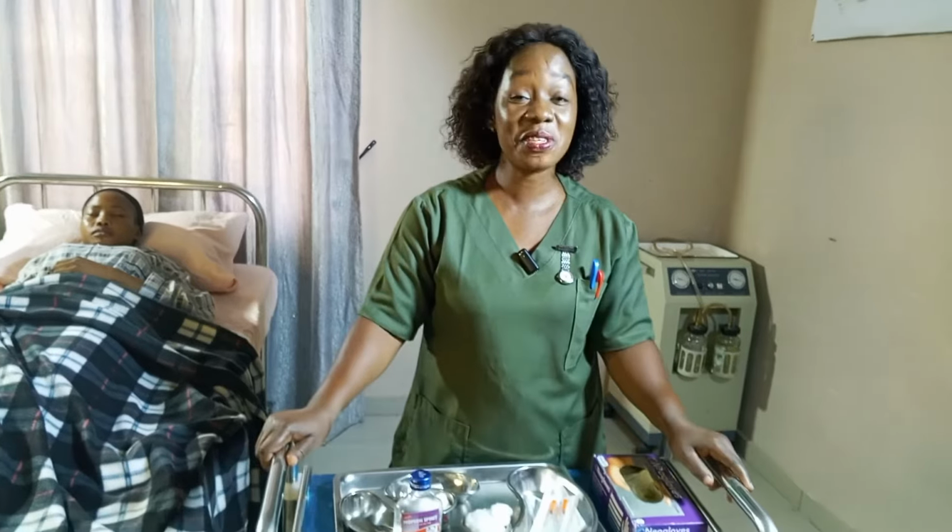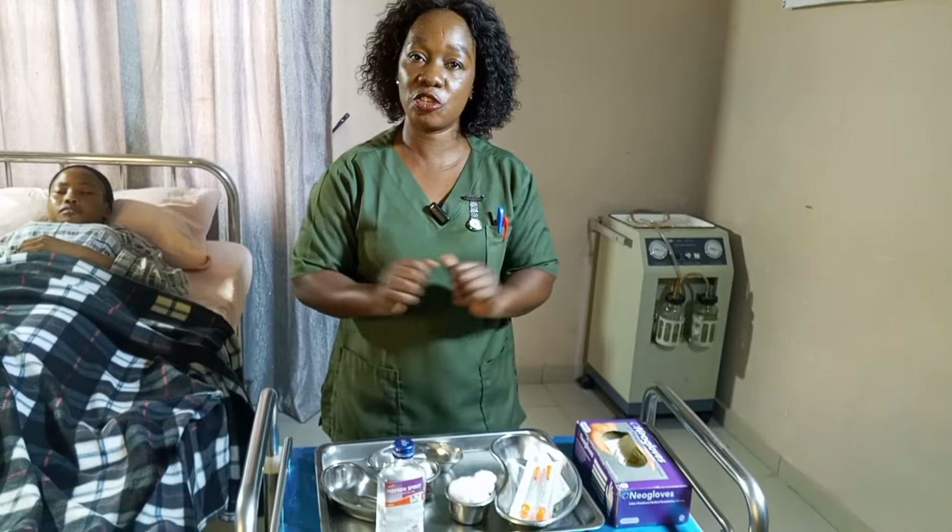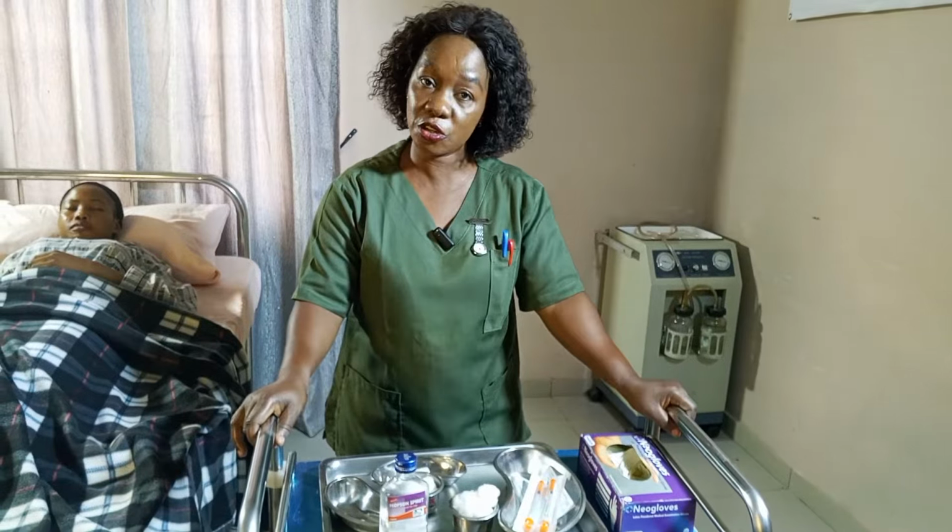And on today's episode of Nurse Clement B, I'm going to teach you how to give a subcutaneous injection. I'm going to use insulin for this procedure. So sit back and watch this video till the end.